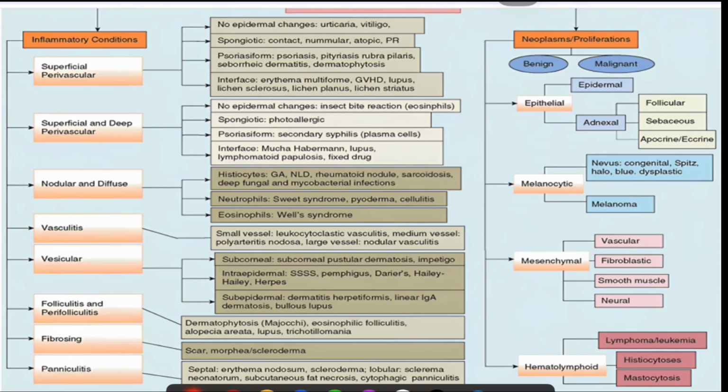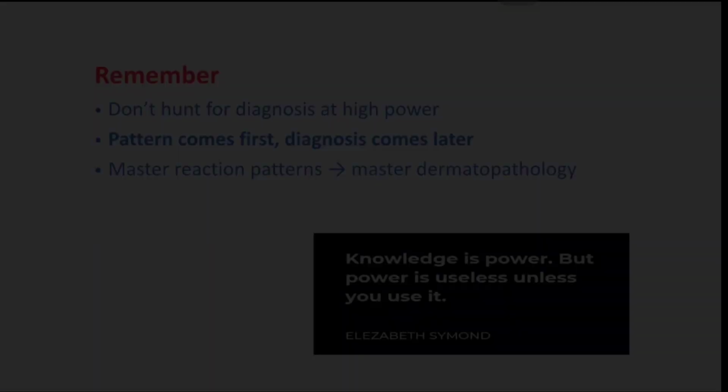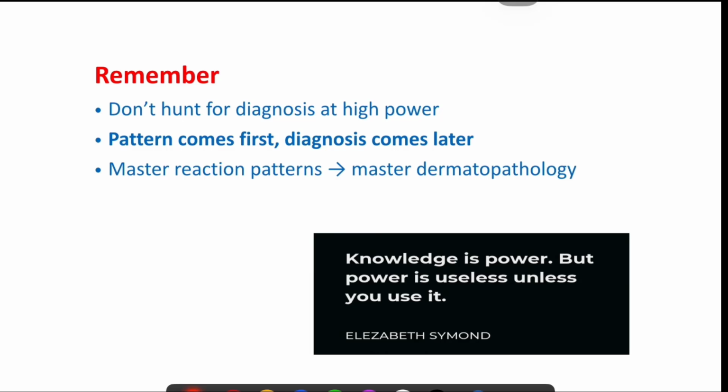So thank you, and keep reading the slide, not the diagnosis. And remember, don't hunt for diagnosis at high power. Pattern comes first, diagnosis comes later. Master reaction patterns so that you can master dermatopathology. And yes, knowledge is power, but power is useless unless you use it.